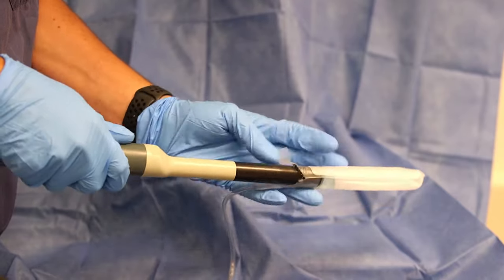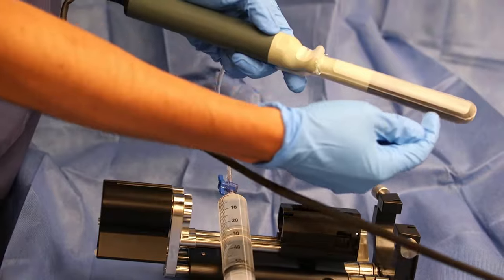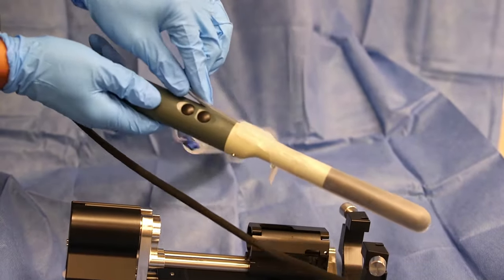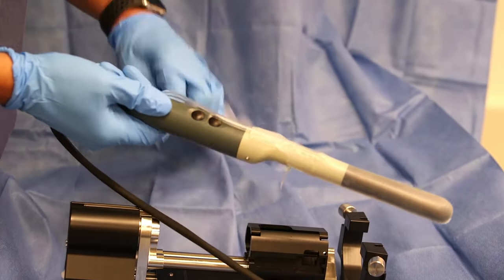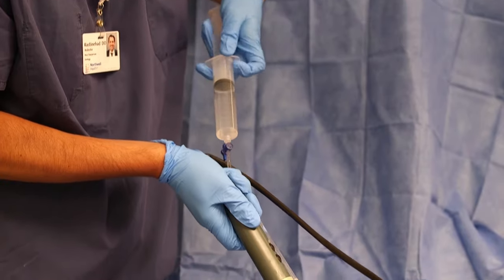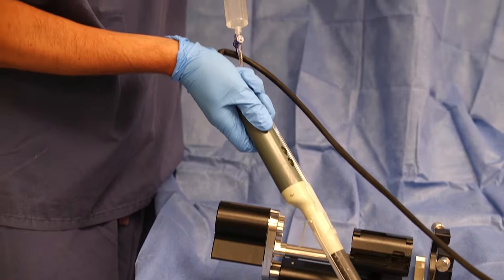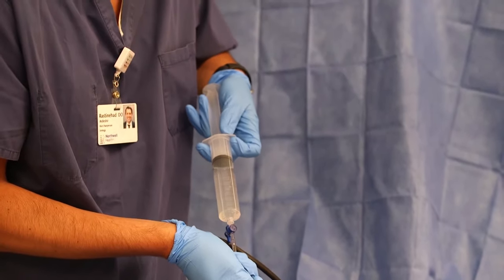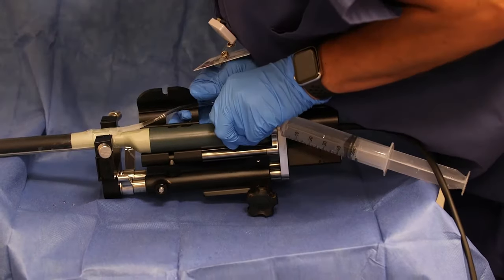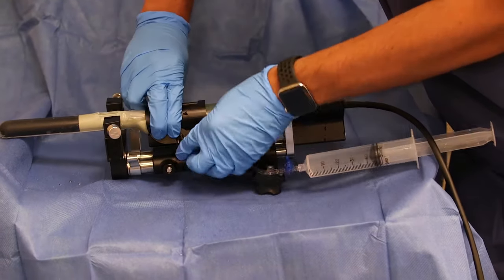The ultrasound probe is inserted into the probe cover upside down and with the probe tip angled towards the ground so that air collects on the opposite side of the transducer. The probe cover is then inflated with water from the Luolock syringe. Air is then aspirated with the probe tip angled towards the ground in order to degas the probe cover. Physically tapping the air bubbles can also facilitate their release. The probe is then loaded into the stepper, with the metal pin and water tubing on the lateral aspects sliding into their respective grooves, and then screwed into place.